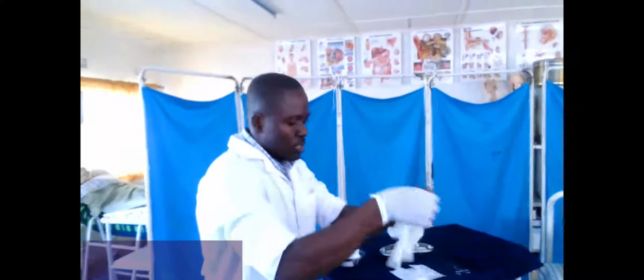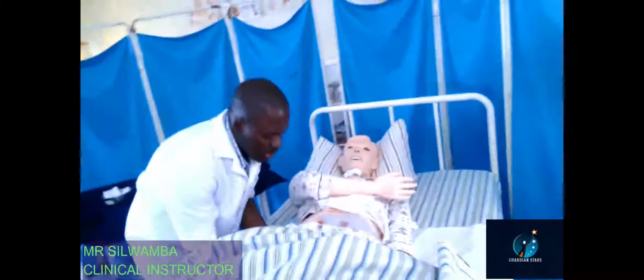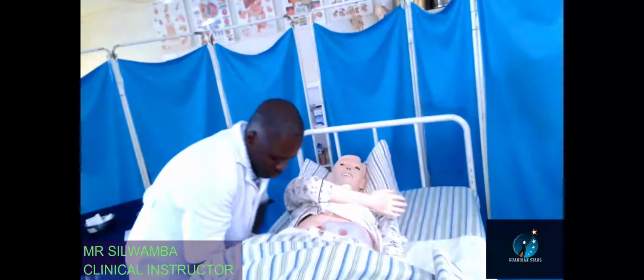So at this moment, I can go back as I promised Mr. Mwila to say I will come back. Then I can don gloves. These are examination gloves, they're not sterile gloves. Since I promised I'll be back, I have to go back, and then place the incontinence sheet under. So Mr. Mwila, let me just place it under. Mr. Mwila has allowed me. So that incontinence sheet is gone down.